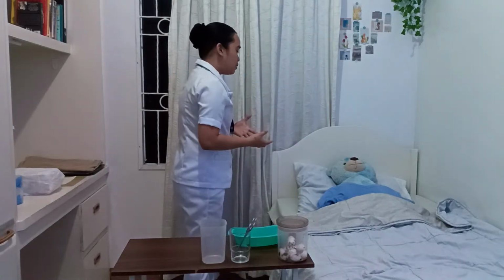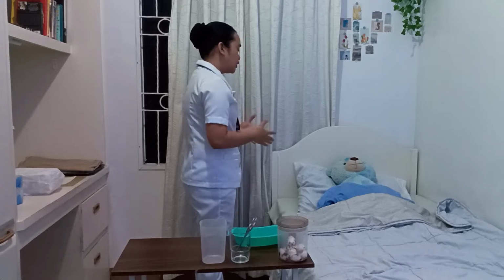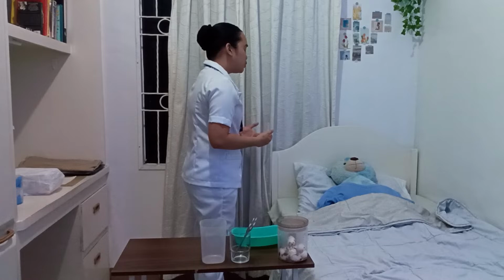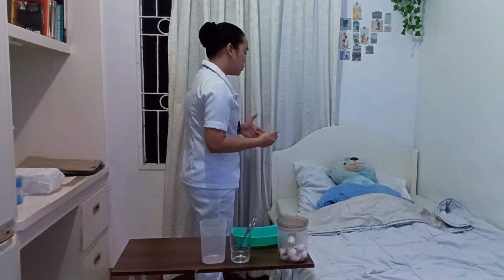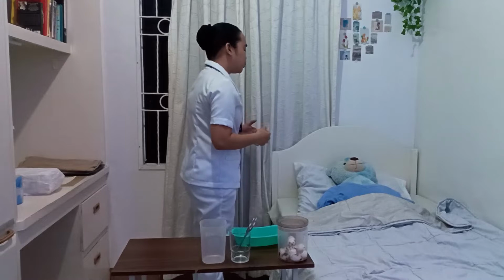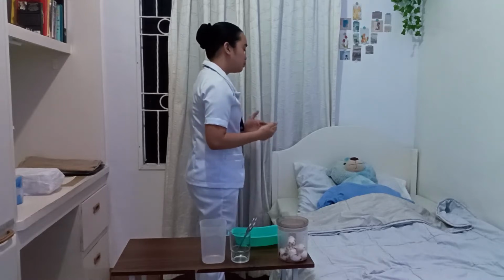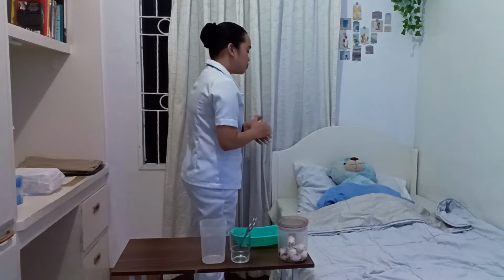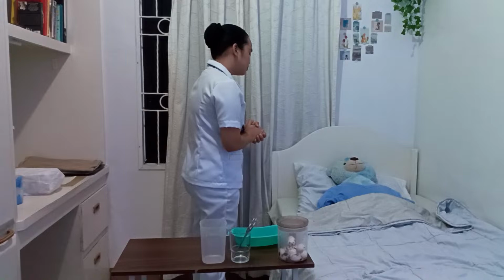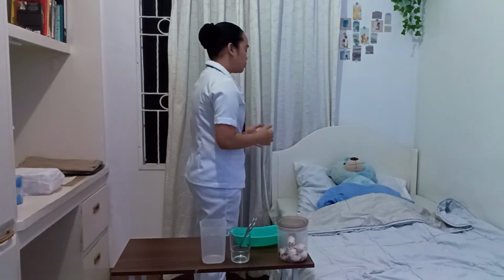Okay, so today ma'am, since you have a difficulty urinating, your attending physician Dr. Kenneth has ordered for you to have a urinary catheter. So what I'm going to do now ma'am is I'm going to insert a tube into your urethra and it will connect into your bladder for you to excrete your urine. And also ma'am, I would like you to be informed that during the procedure, I am going to expose your genital area. Would that be alright with you, ma'am? Okay, so do you have any questions, ma'am, or clarifications before we proceed?